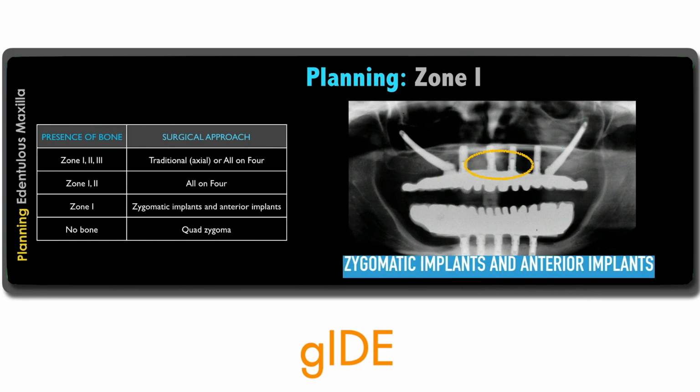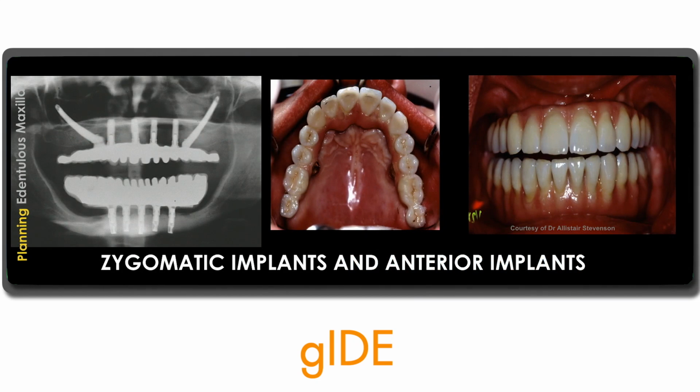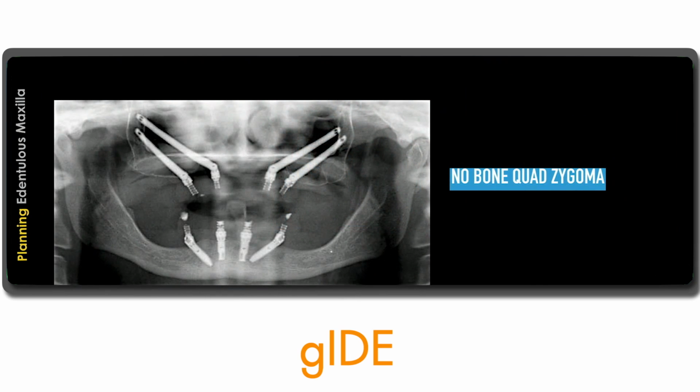So if there's only bone in zone 1, then you'll be looking at anterior implants, and posteriorly you would place zygomatic implants. And these are 30 to 50 millimeters long that engage the zygomatic buttress and also the bone crest. And you'll see with zygomatic implants, they emerge more palatally. So you can see in the 1.5-1.6 region and 2.5-2.6 region, the access point of the zygomatic implants is more palatal. If you have no bone in zones 1, 2, and 3, then you would look at quad zygoma as a treatment option for the patient.